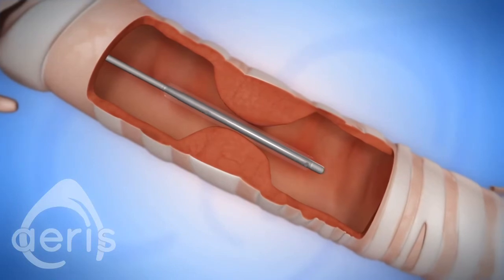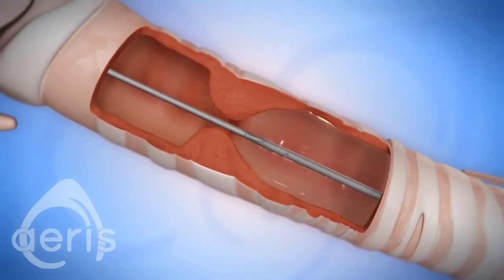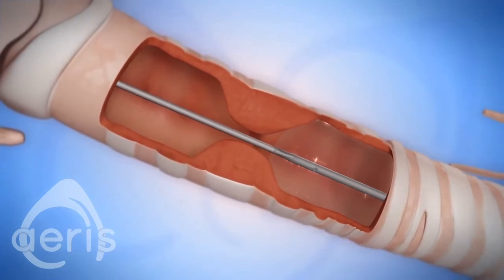However, slippage of the balloon catheter as it inflates is a common problem, resulting in extended surgical time or an abandoned case.